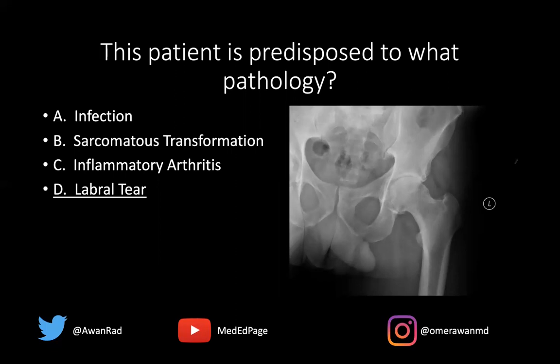On this frontal view of the left hip, notice there's no acute fracture, but we do have this finding here. There's an osseous protuberance at the femoral head and neck junction. Normally in a hip, you'll have a nice offset between the femoral head and neck — a nice concavity — but we've lost that with this bump here.